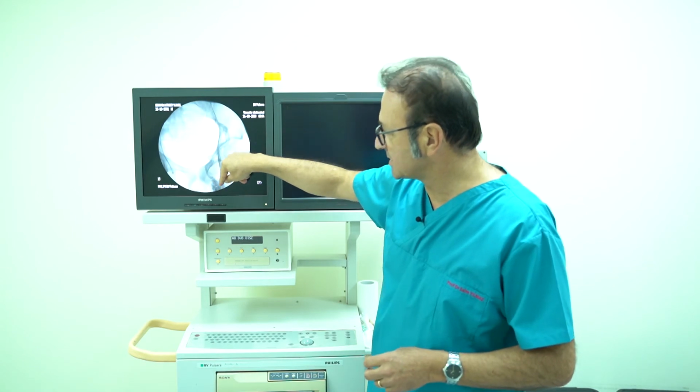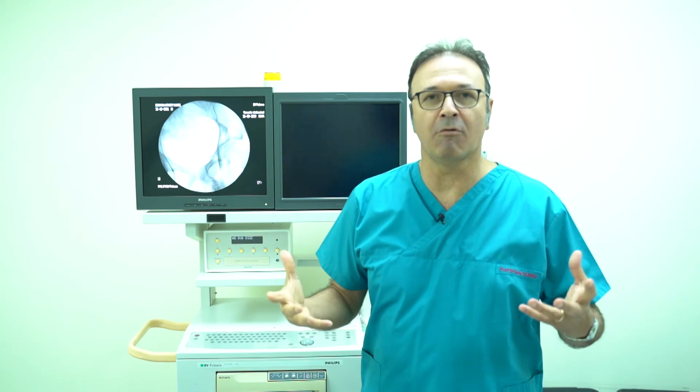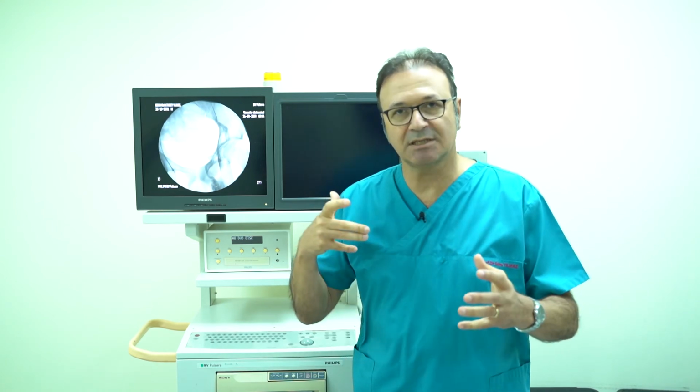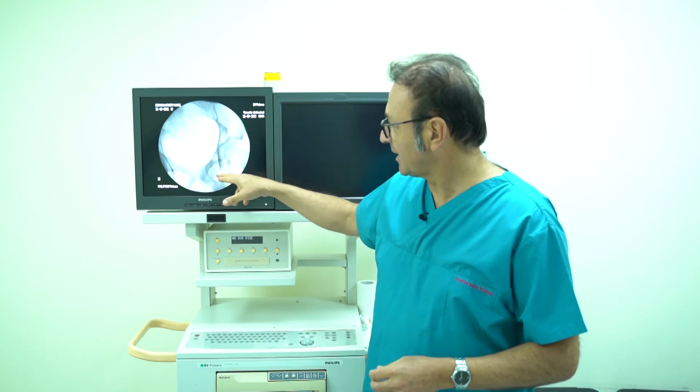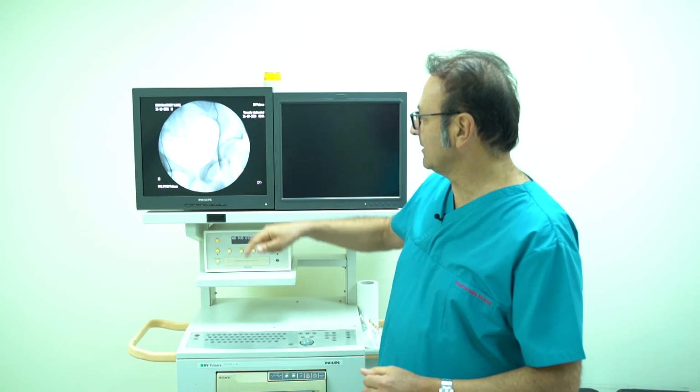What we do afterwards is to put a microcatheter through this catheter, and we advance the microcatheter into the varicocele here, and then we inject a sclerosing foam that we also use in the treatment of varicose veins. So we inject this foam into the varicocele, and in this way we treat the varicocele first.